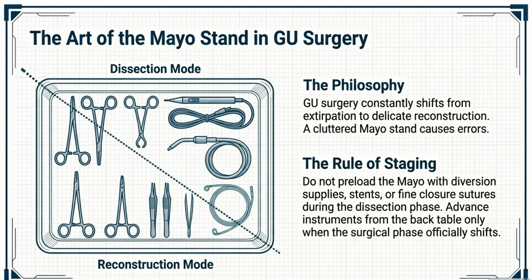This slide emphasizes integrating different surgical approaches and techniques. Understanding when and how transitions occur is crucial. The technologist must adapt quickly between phases. Mastery comes from recognizing patterns across procedures.